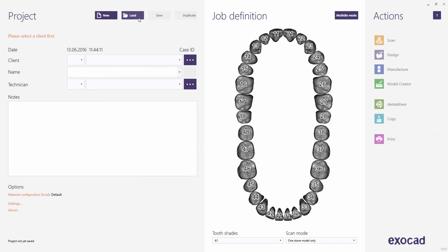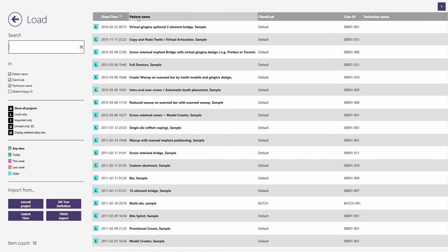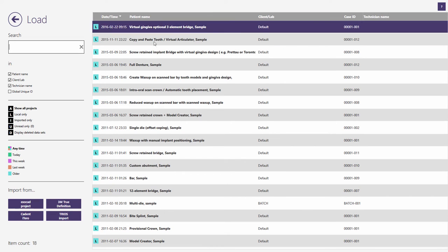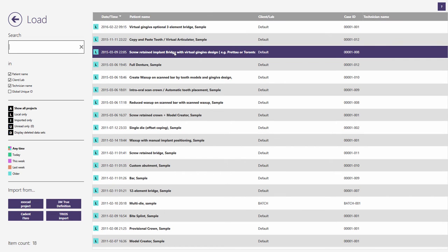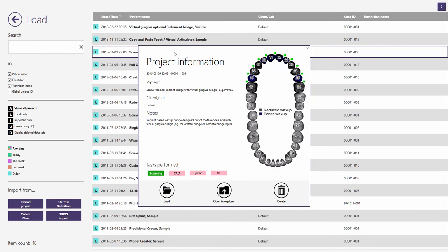This quick guide tutorial from ExoCAD shows how to use the retention cutback library to design an implant bridge type wraparound. You may try this with the demo sample called Screw Retained Implant Bridge with Virtual Gingiva Design.